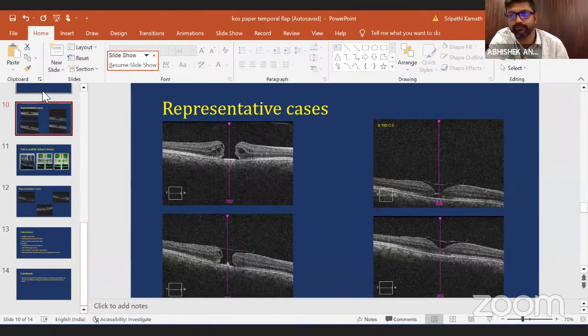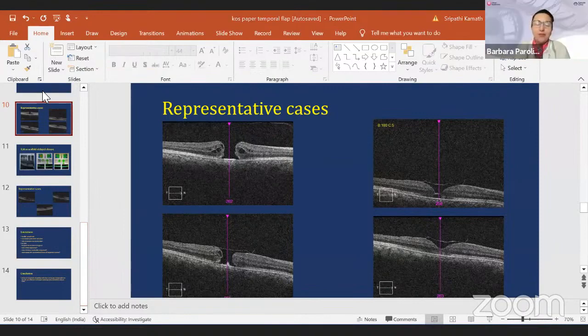It's a very interesting discussion. I find that whatever shape and whatever size of flap we are using, if the flap goes inside the hole and gets stuck, it prevents the real closure. And at that point, the visual acuity does not increase. So I would like to know what technique, if you have one, you try in order to avoid that the flap sticks inside and prevents the real closure. Do you have any tip?